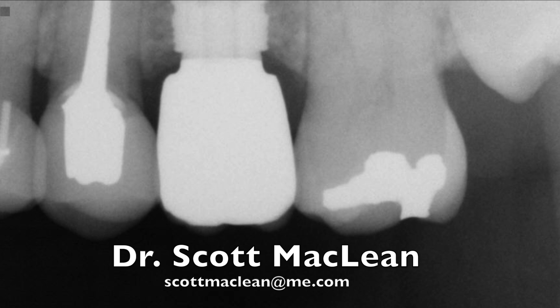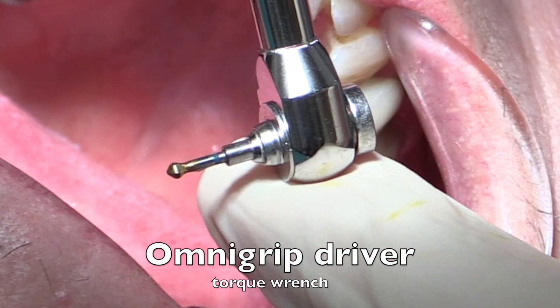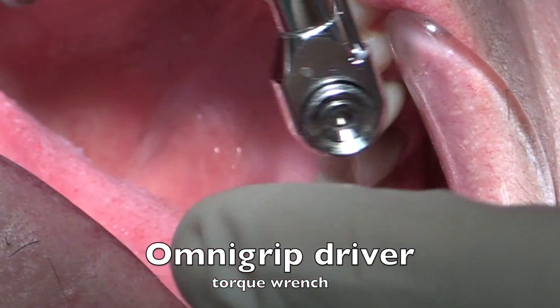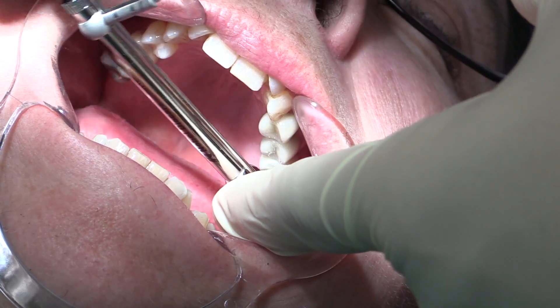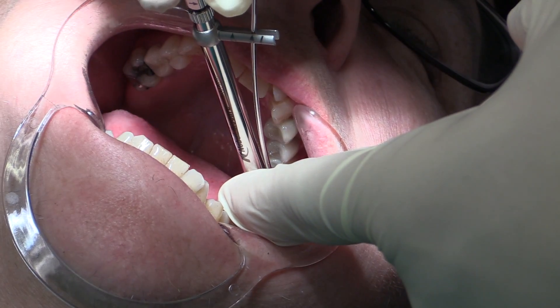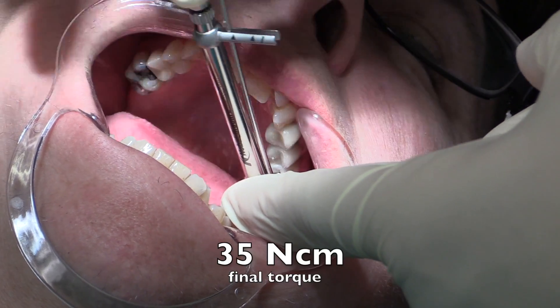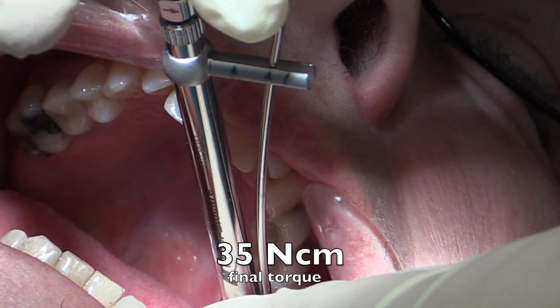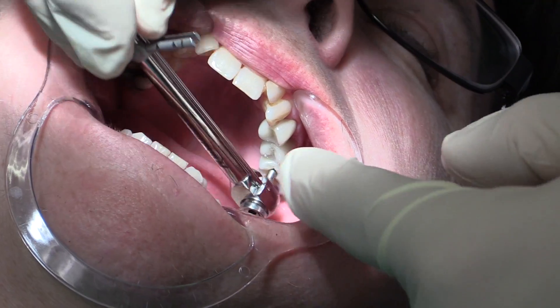You'll also notice this is a solid piece of zirconia — there's no porcelain added on, so it's going to be a very strong and very durable crown. We use the OmniGrip driver in the torque wrench to put this assembly together and tighten the implant crown down. We're tightening this to 35 Newton-centimeters, which is the final torque on this particular crown. Getting up to 35 Newtons should not affect the screw whatsoever.